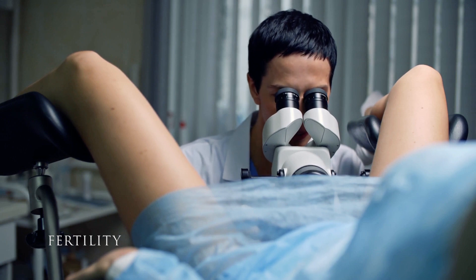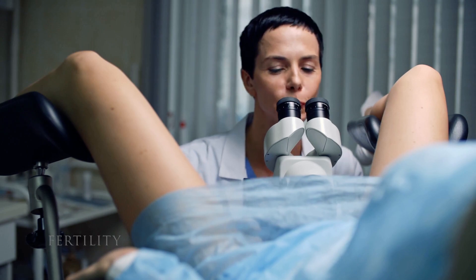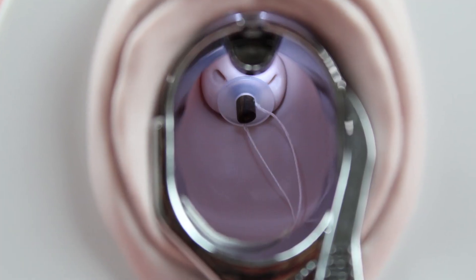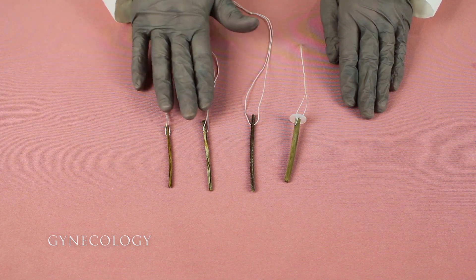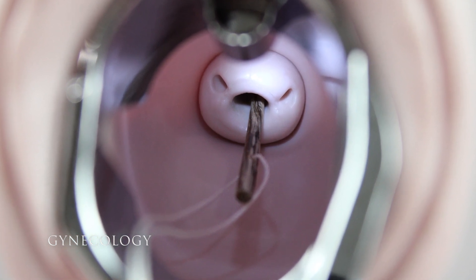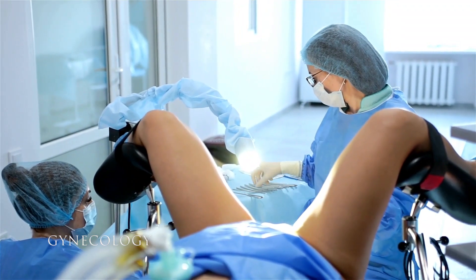Infertility clinics utilize its natural strength and even expansion to prepare patients for a wide range of procedures that require unobstructed access to the uterine cavity. These clinics usually prefer the Laminaria with the button to ensure that the uterus remains undisturbed. Clinics performing dilation and curettage will usually choose the regular or long Laminaria depending on the patient's needs and the practitioner's preference. With the cervical canal opened evenly through its entire length, the clinician can perform the needed procedure with ease.